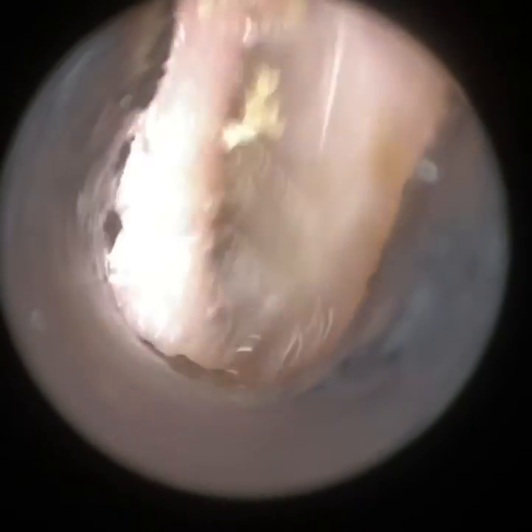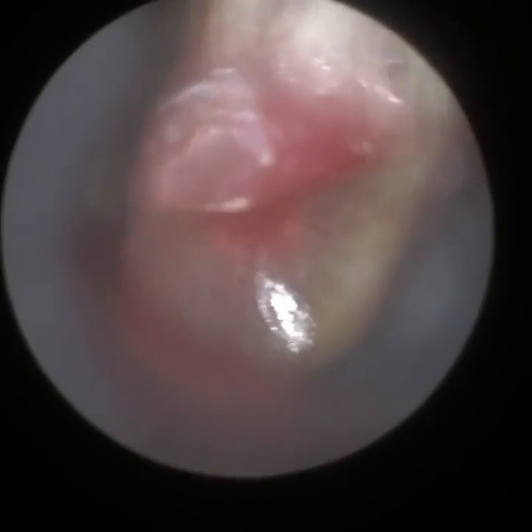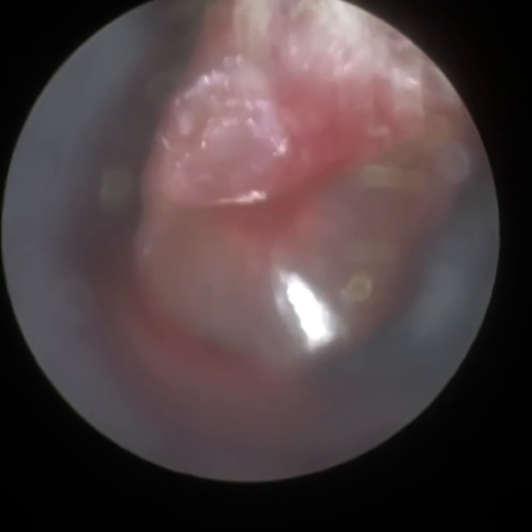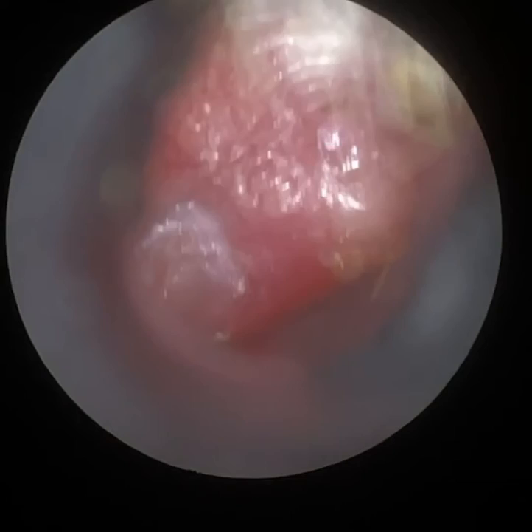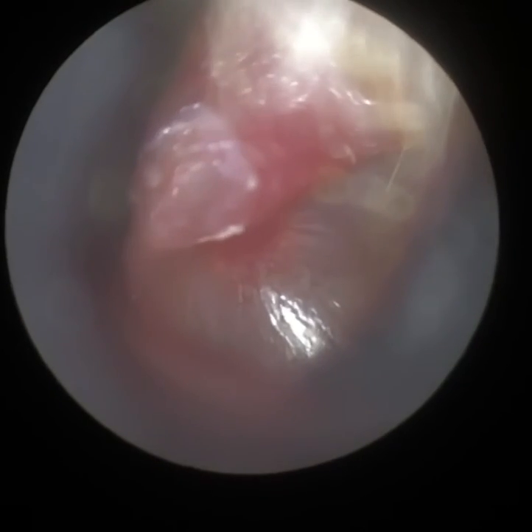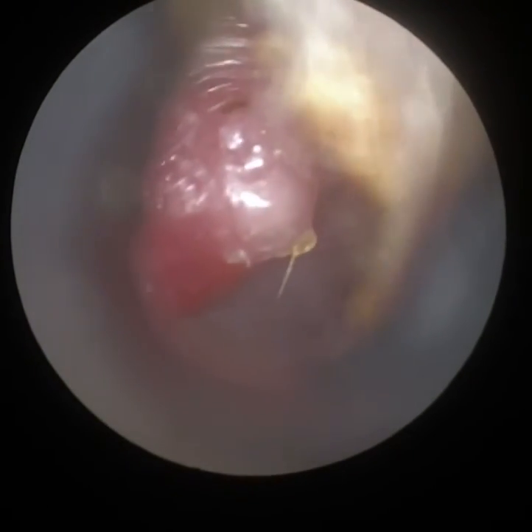And there we are. I'm going to go back into the ear — you're going to see the eardrum come into focus. There's a bit of vascularity, a bit of inflammation, but otherwise it's nice and healthy. I think the wax plug was attached to the eardrum as well — probably some skin attachments posteriorly. You can see some skin there that was probably attached to the wax, and as we brought it away it separated from the eardrum.